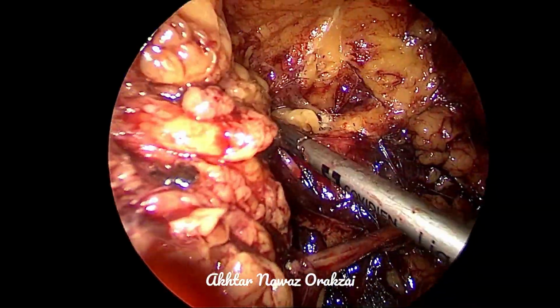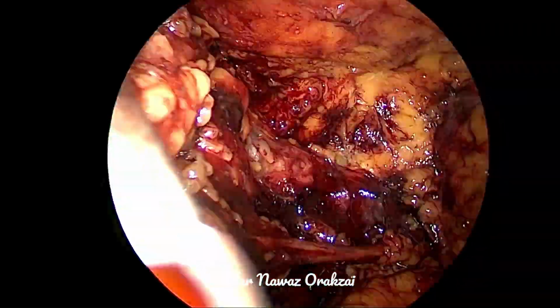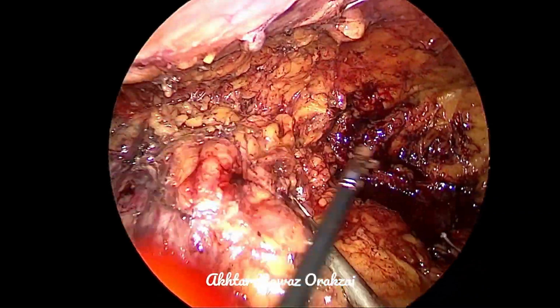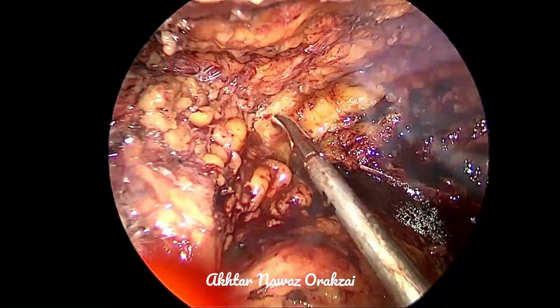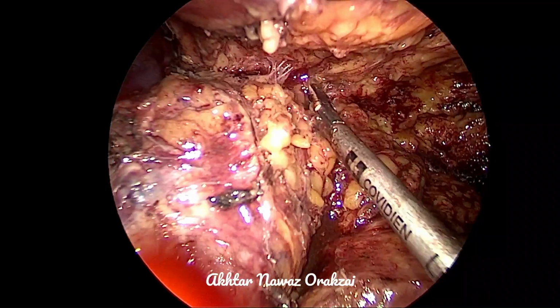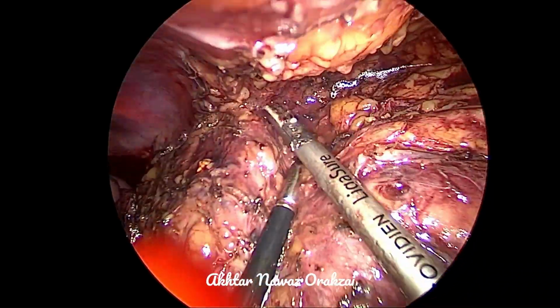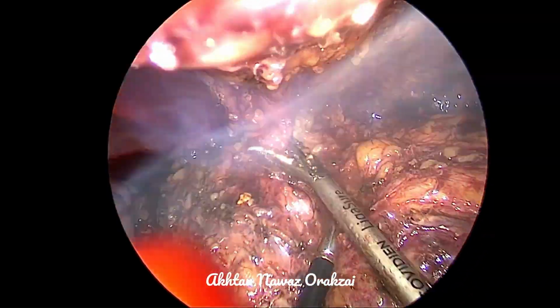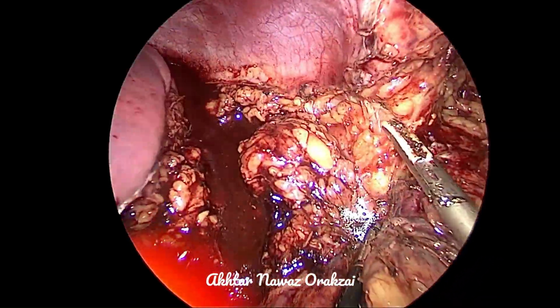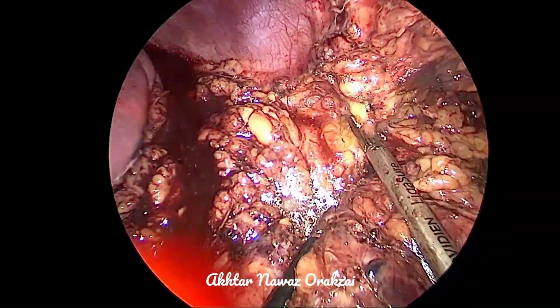So that was the main purpose of sharing this video, number one, to show the beginners and the trainees and the young laparoscopic surgeons that difficult cases can also be performed laparoscopically. However, these are the things that one has to keep in mind: the diaphragm, the spleen, the tail of the pancreas. Once you have those things in mind, one can really save them.